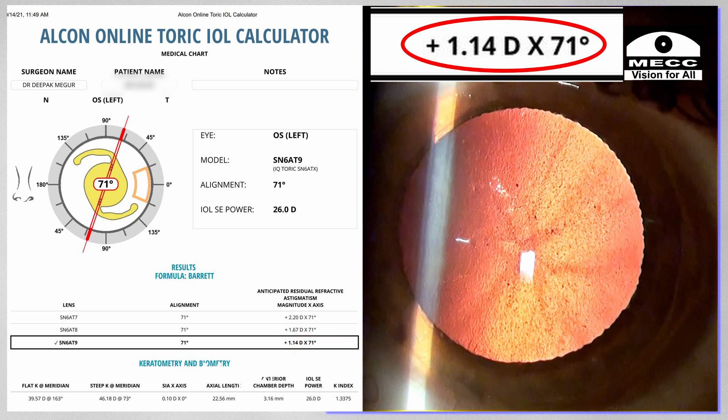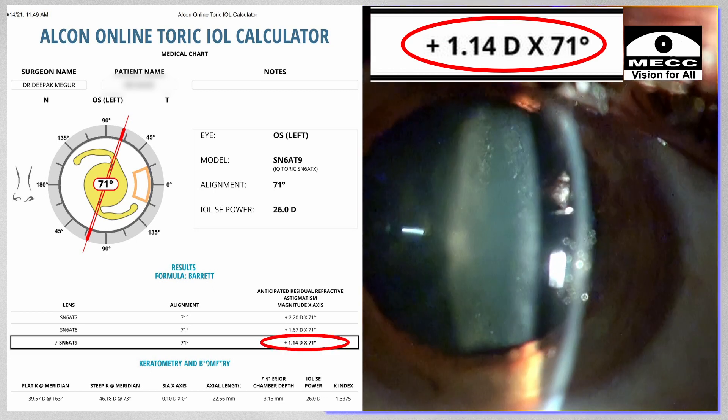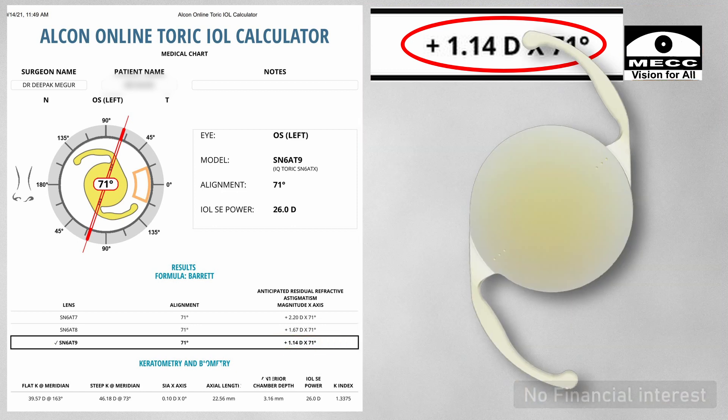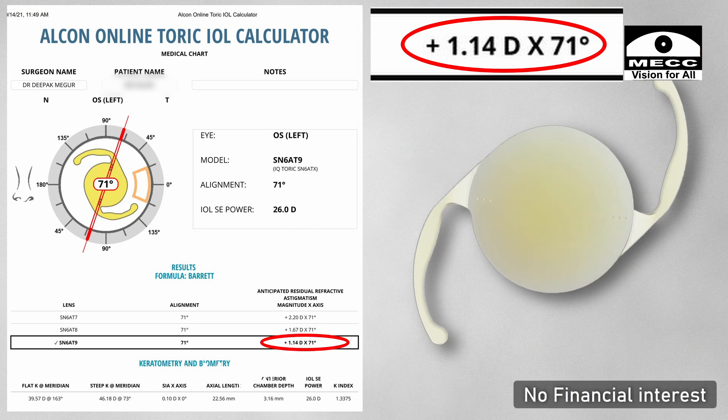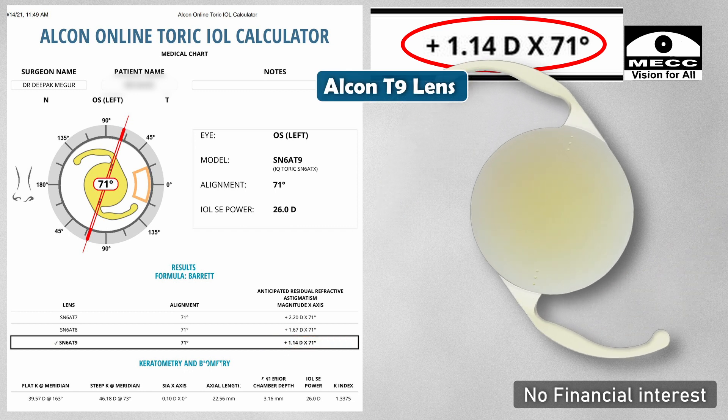The calculations tell me that he is going to end up with a residual astigmatism of one and a half diopters of cylinder, since that is the maximum which can be corrected with the Alcon T9 model, which has got the highest cylinder correction.